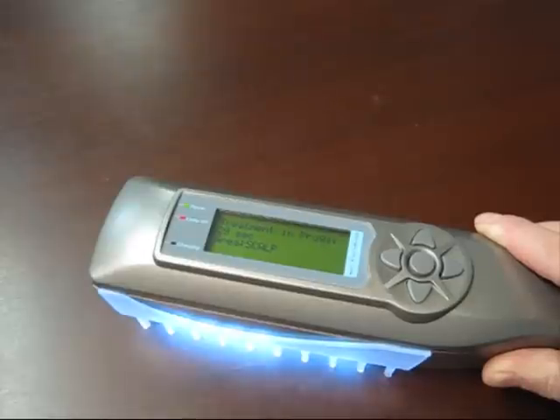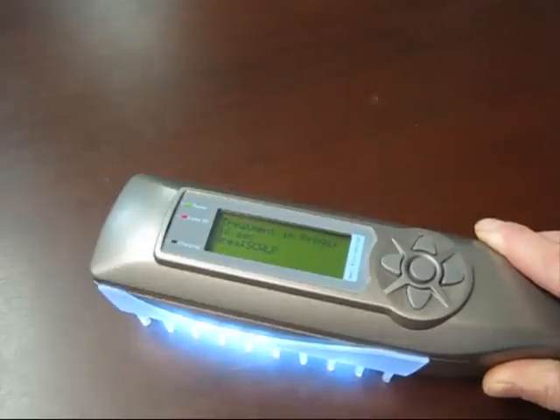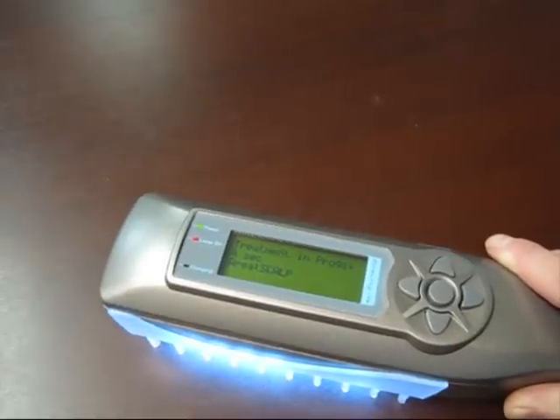It'll count that down, and once that treatment is finished, you'll see what will happen. It'll ask to go to the next area and indicate to move to the next treatment area, and it will also start a new timer for that new treatment area. So you can't really miss a treatment area, and you can't really overexpose if you follow the instructions. It beeps every now and then to let you know it's turned on and activated, and it'll beep again when this time is finished. It's down to 6 seconds now, 5 seconds.